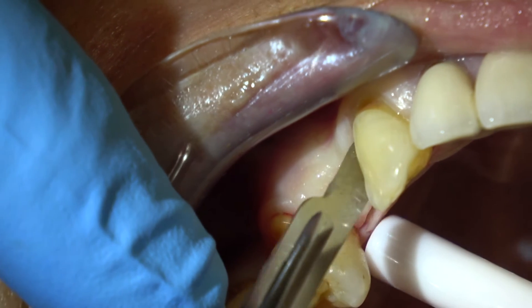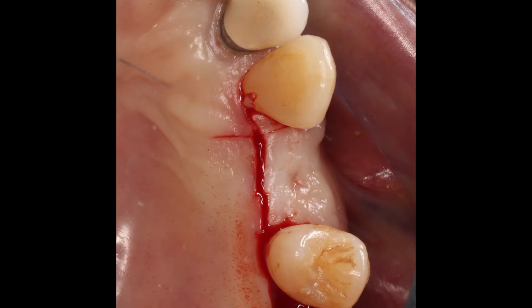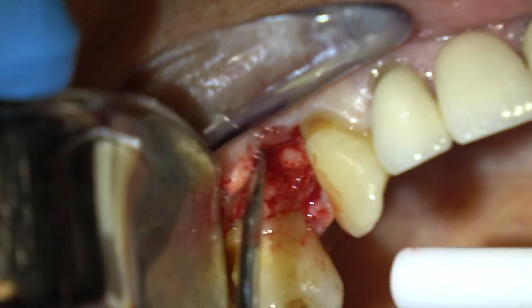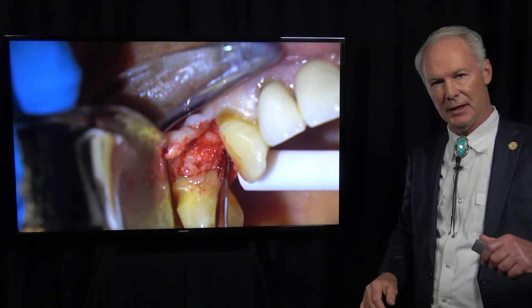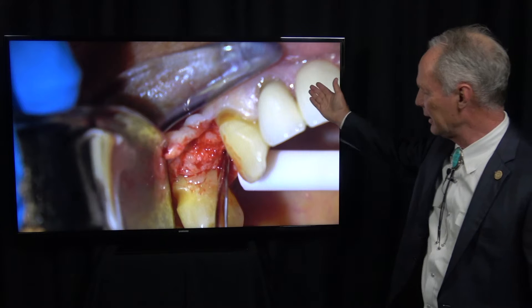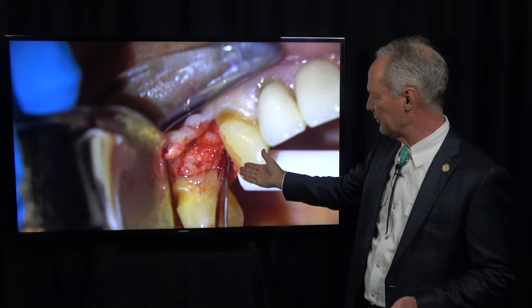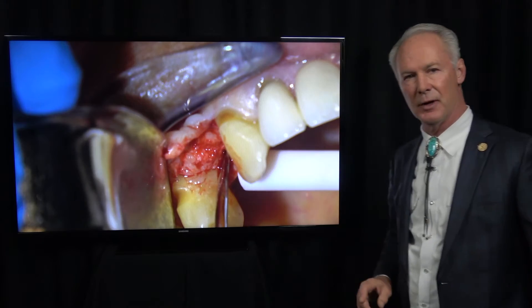This is an incision on the palatal surface, approximately in the sulcus of each of those teeth. Then I'm going to reflect this — always reflect from the palatal to the facial, and then you're just dealing with one flap. Don't ever make your incision right down the center of the extraction site, because then you have to deal with two flaps. Incise and reflect from the palate to the facial so you deal with just that one flap.